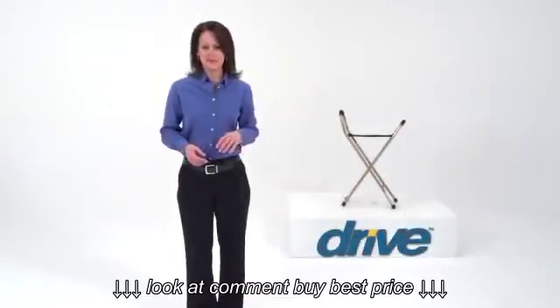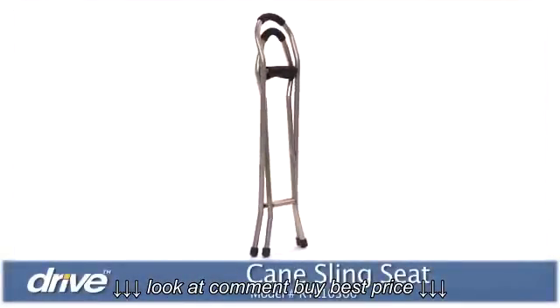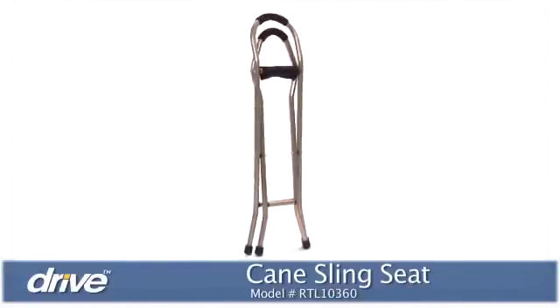Having the ability to conveniently rest can make an outing more enjoyable and last longer. Drive Medical's Sling Seat Cane provides you or your loved one with a comfortable, stable solution.